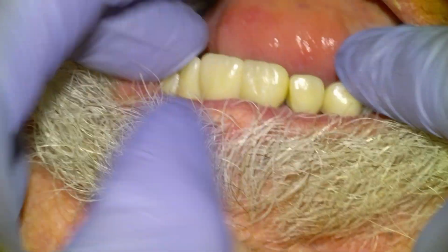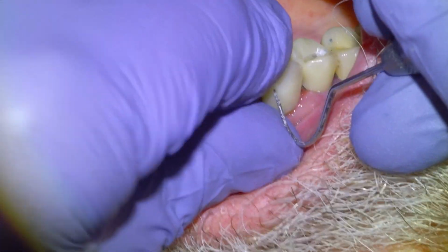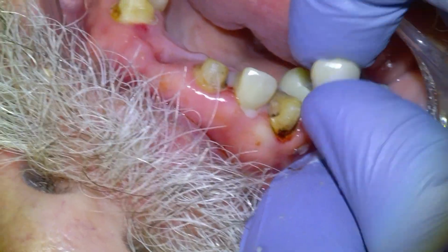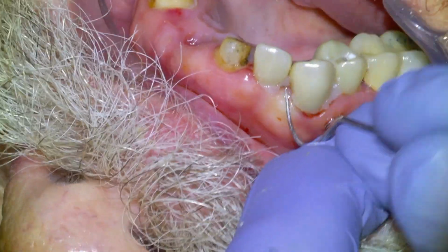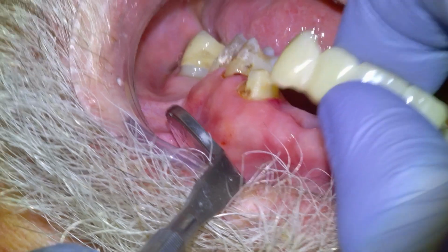Not exactly a Hollywood case, but we did what we could with what we were given and the budget that we had. And so we're going to take the teeth out, going to pumice the preps, condition the insides of the crowns, and then load them up with some resin cement and seat them down. We're going to set the cement with our Valo Grand, and then the crowns are in place. Going to clear off the excess resin cement with an explorer, and then do the same thing for the bridge.